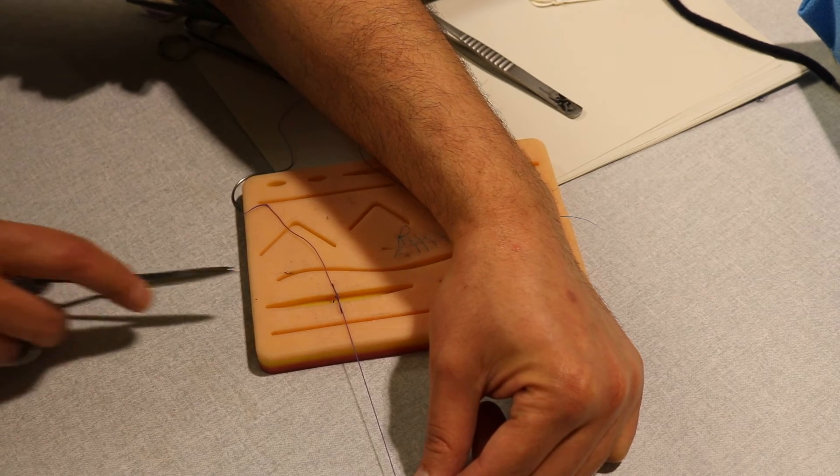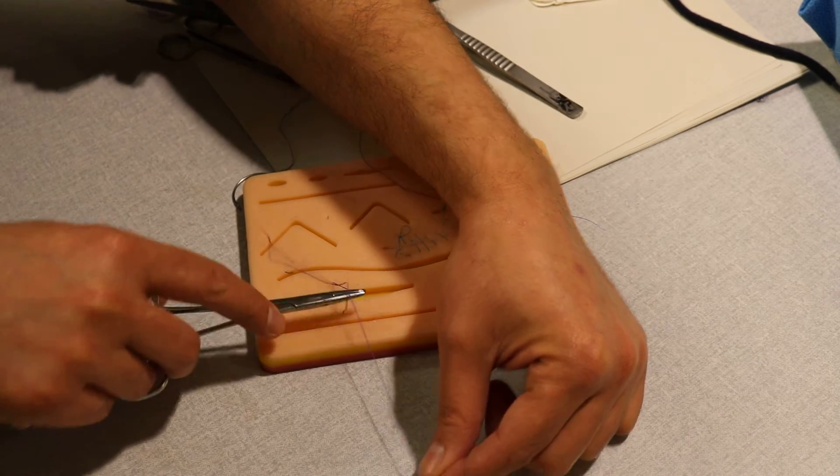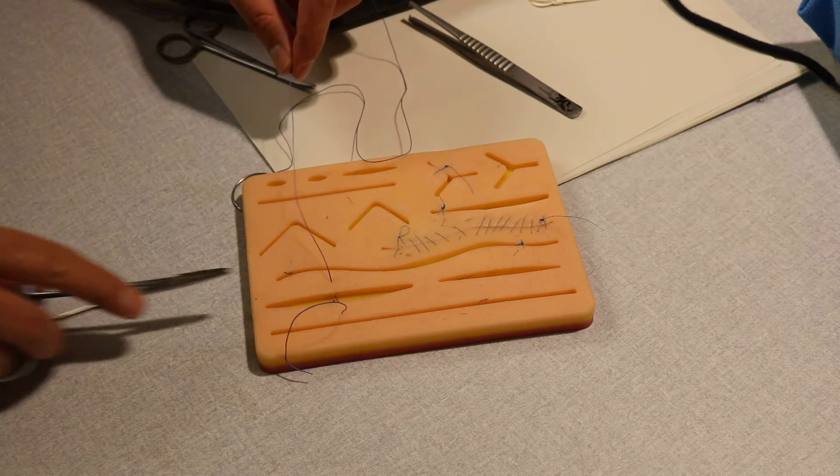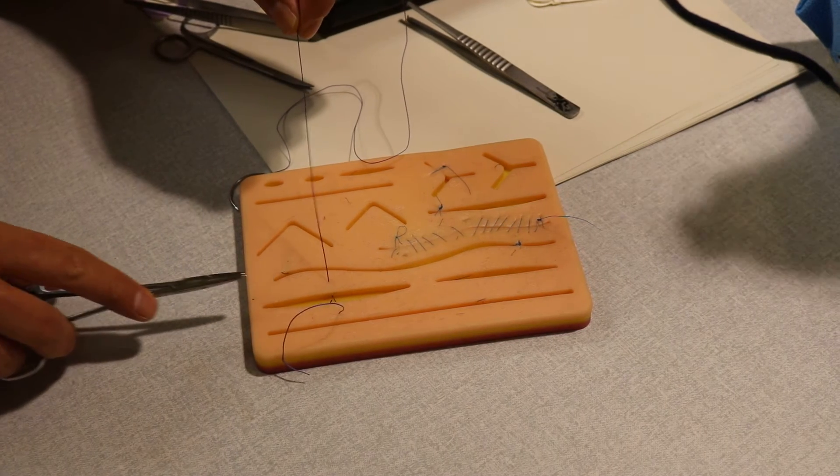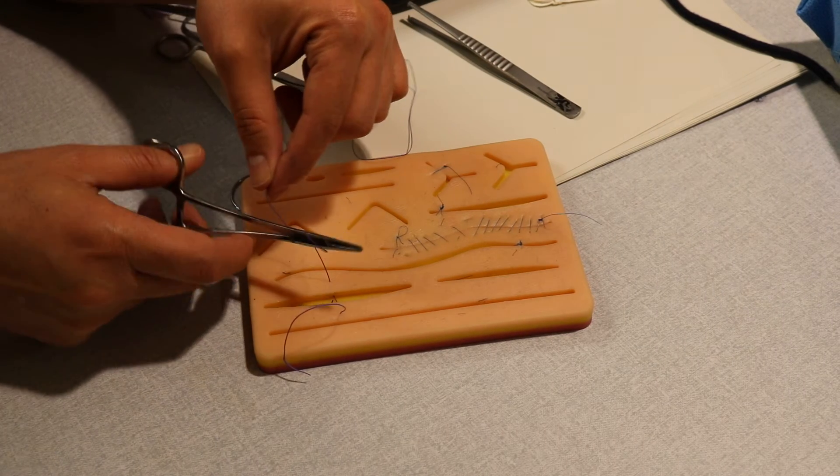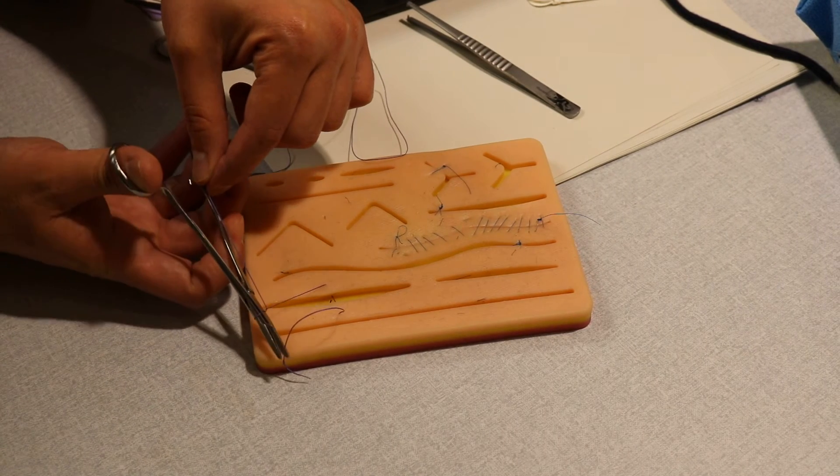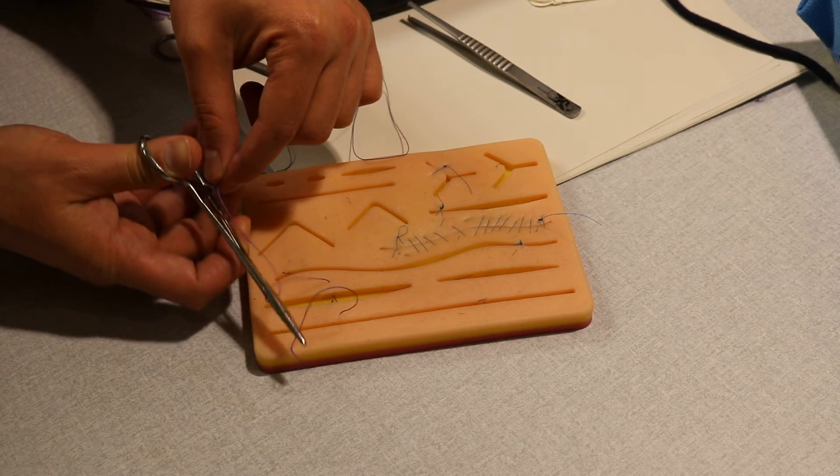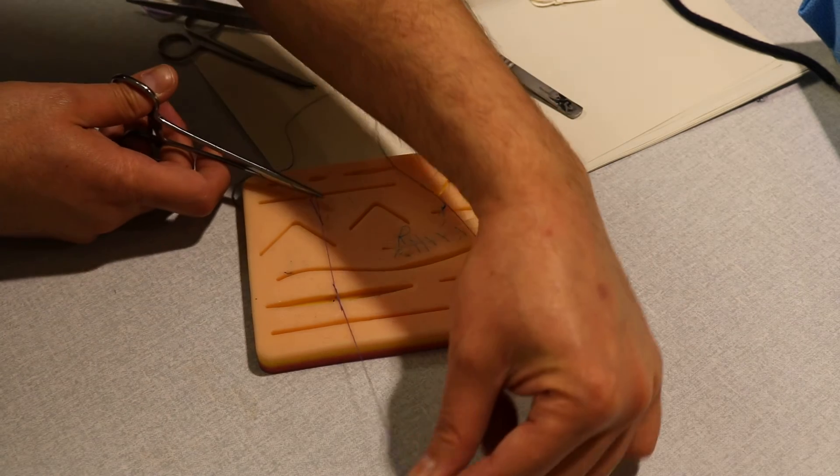That's the first one. The second one: fine, again, one loop here. Go in the middle parallel to the wound and go with the tip to hold the tip again. Bring that side to the other side, switch them.